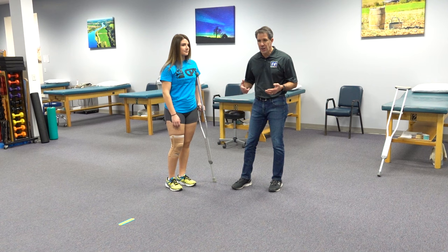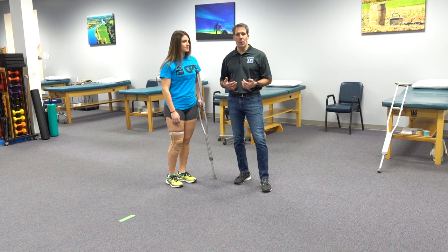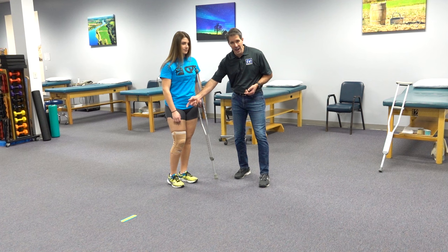Once you have been able to use both crutches and you're comfortable with that — at a partial weight bearing status and your provider says it's okay to go with one crutch — the way you will do that is use the crutch on the opposite side of the injury.